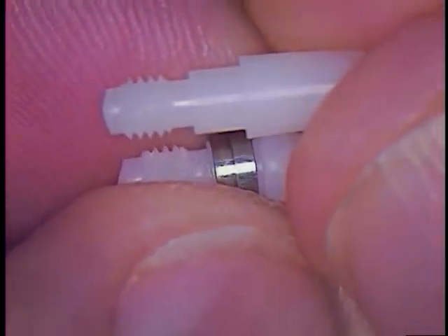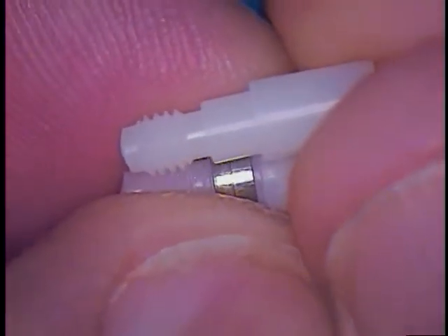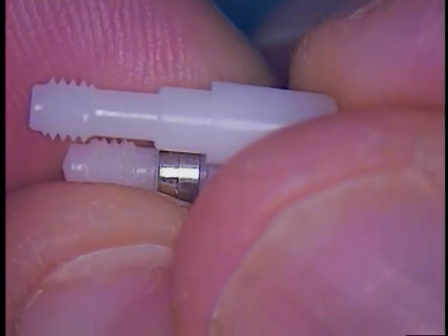If you notice the length, this is the impression coping, which doesn't need a sleeve, and then we have those who do need a sleeve for extra length, which is this one. So this is the extra one for very, very deep areas of concern. All right, so two different types. We'll find out which one we're dealing with in a minute. Could I have that box, please? Okay.